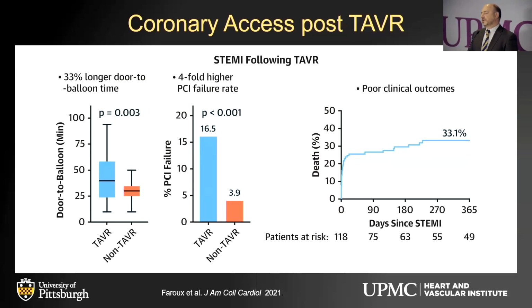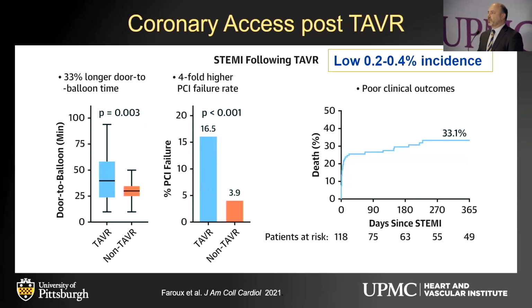This is a Canadian study looking at the STEMI patients who had a TAVR before, and as you can see, the door-to-balloon time is longer. There's a four-fold higher PCI failure in these cases, and the mortality is high. But the important thing is the incidence of STEMI in patients post-TAVR is very low, and this is substantiated by more recent data showing that the need for PCI post-TAVR in the patient population that we currently treat is relatively low.